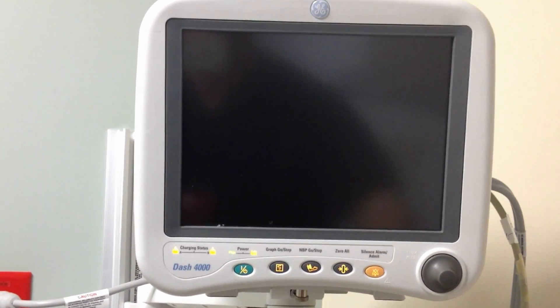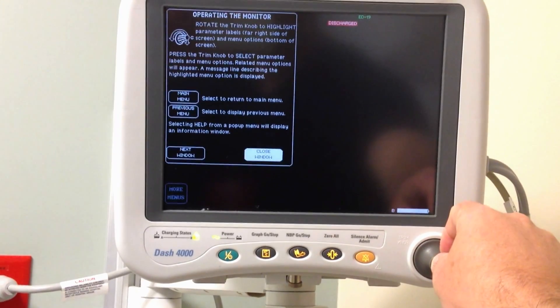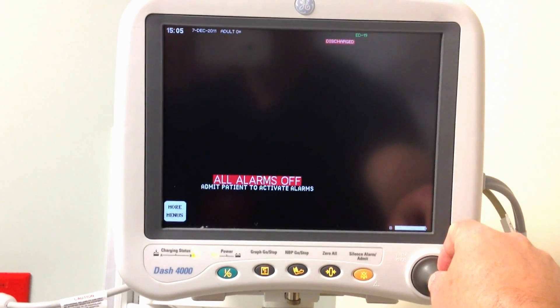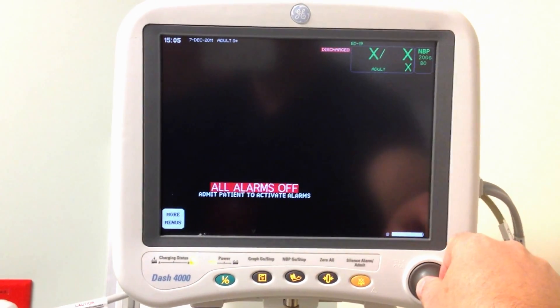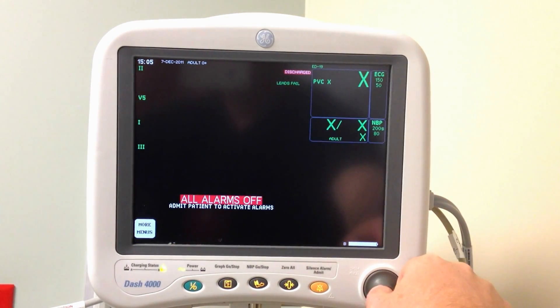Take a second. It's a close window. More menus, we're going to get into service mode.